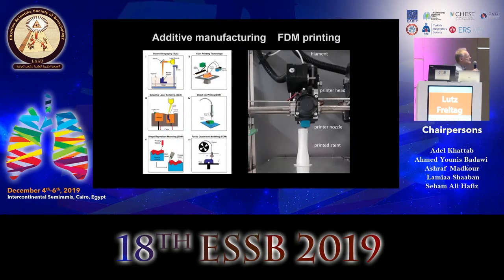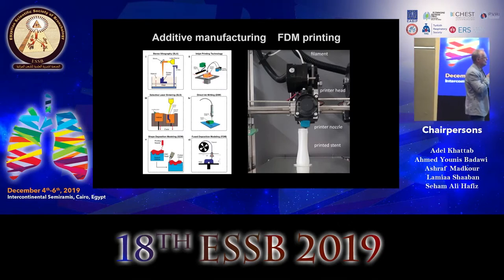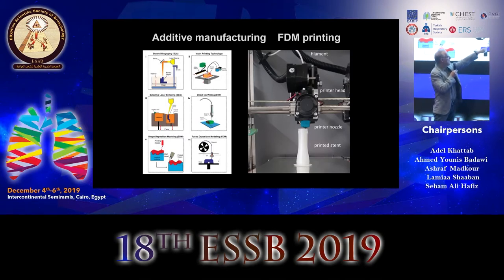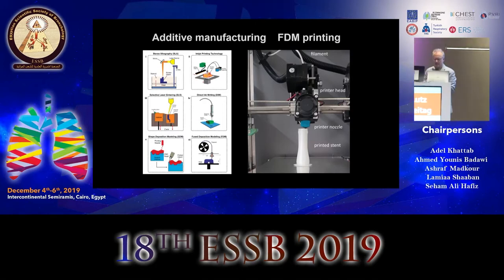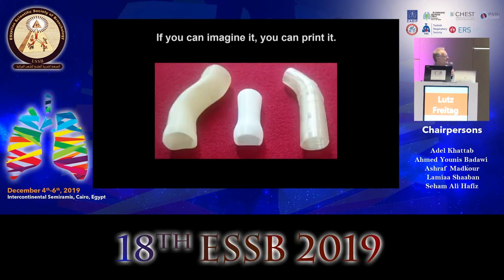There are several techniques, optical techniques, or the technique that I show here, where basically you have a polymeric filament, you heat it up, and the nozzle goes in a specific pattern, and then you create such a stent from basically nothing. And with such a technique, you can print within several hours, sometimes even minutes, whatever is needed. And this is the message: if you can imagine it, you can print it.